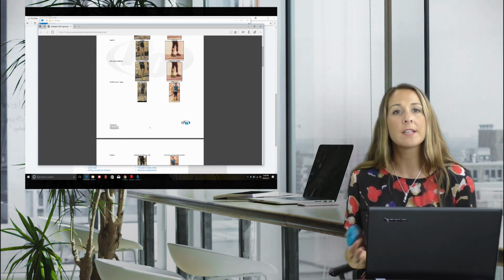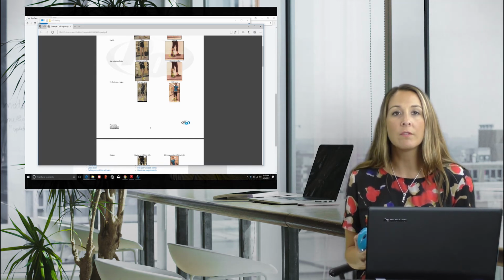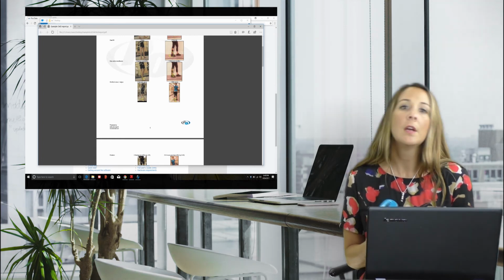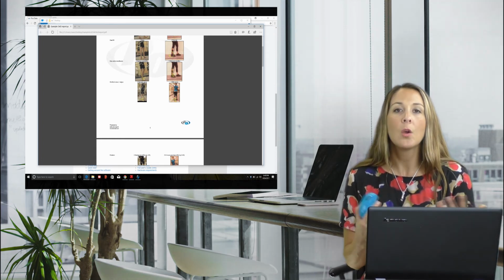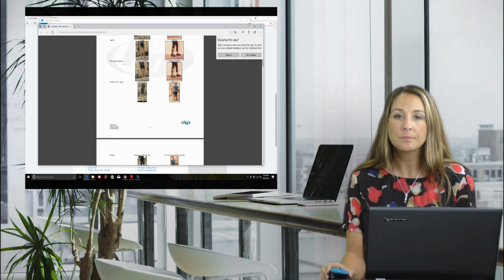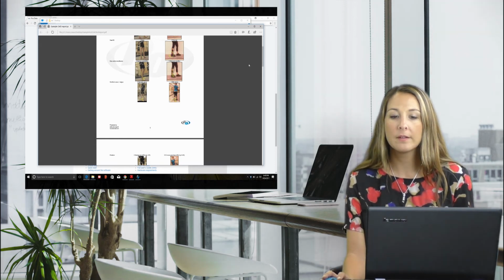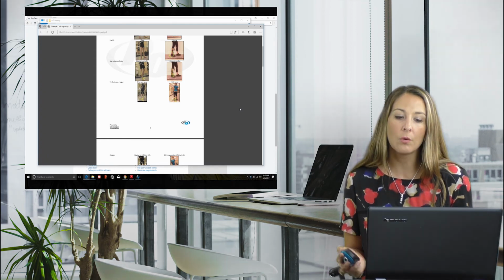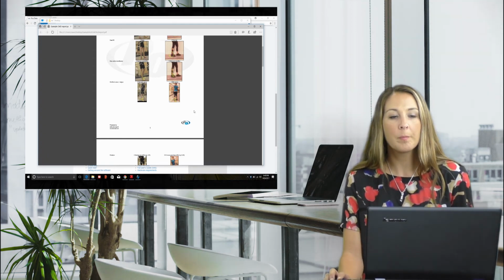You don't necessarily have to have as much of a conversation showing a clinician or a physician, another physical therapist, what you're seeing with your video analysis. The images show it all for you. So that's the idea behind PnO Data.